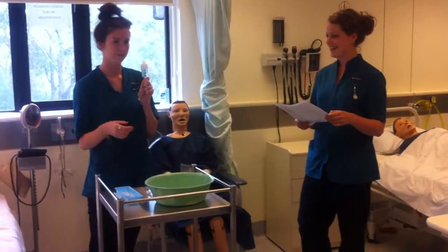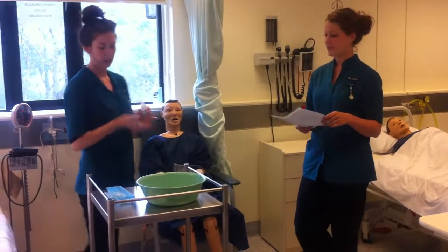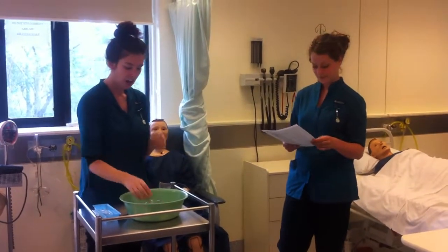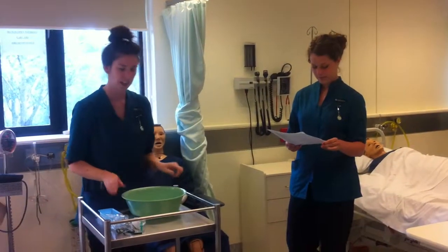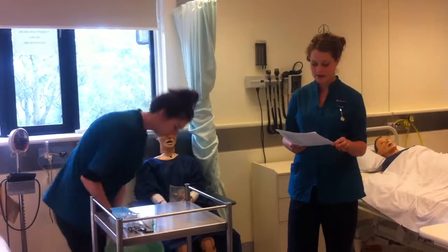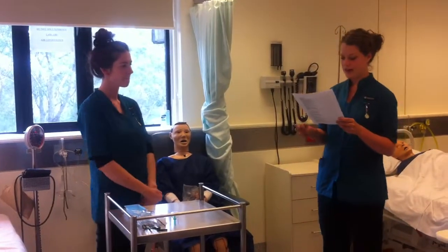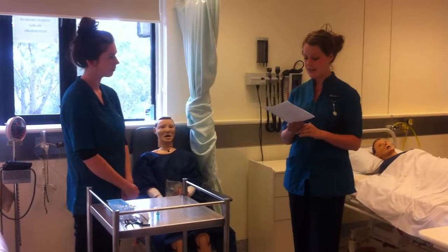So Penny's going to clean it now. You just take the nebulizer apart in 3 different parts. Here's the first, and you just put it in warm soapy water. Here is the second and the third. You give that a good wash, then you take it out and leave it to dry, or dry any extra parts in paper towel. Particular attention should be paid to the bore nozzle, which is this little thing up here, because this can become blocked and the drug next time won't be aerolysed sufficiently.